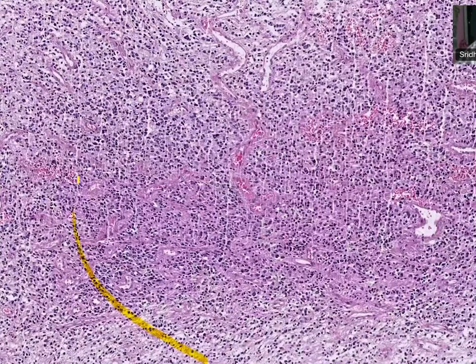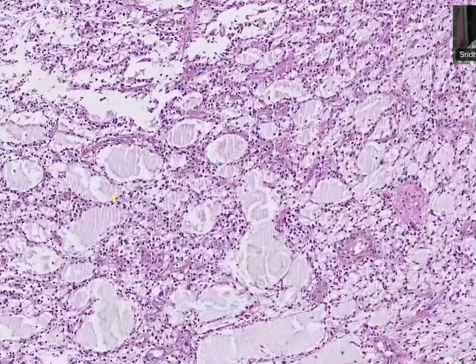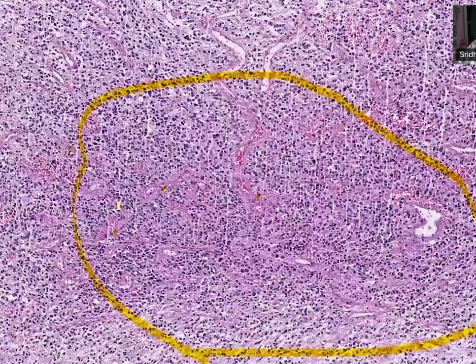In that area you saw low cellularity. This is compact, cellular crowding type. There is hardly any space between the tumor cells, and there are nests of cells arranged compactly, showing variation in size also. What you can see here are vessels, proliferating blood vessels. These are the microcystic spaces in the higher power. So they are not really microvascular proliferation, but they are subtle, so they are doubtful.